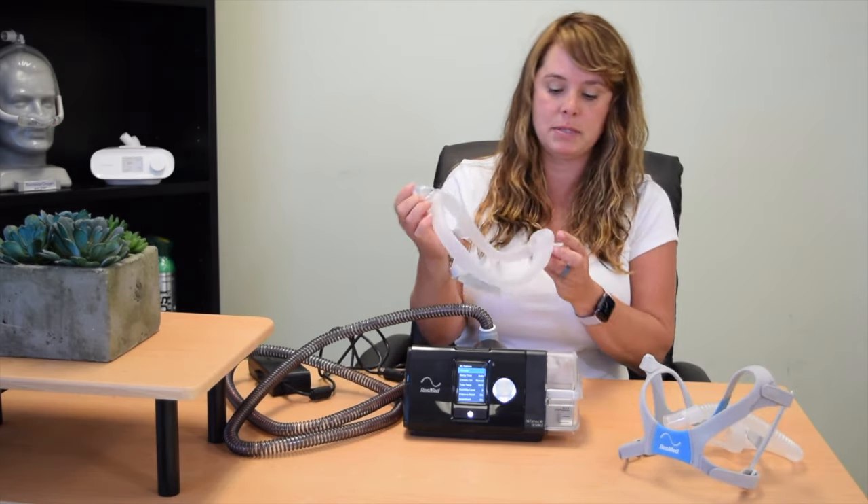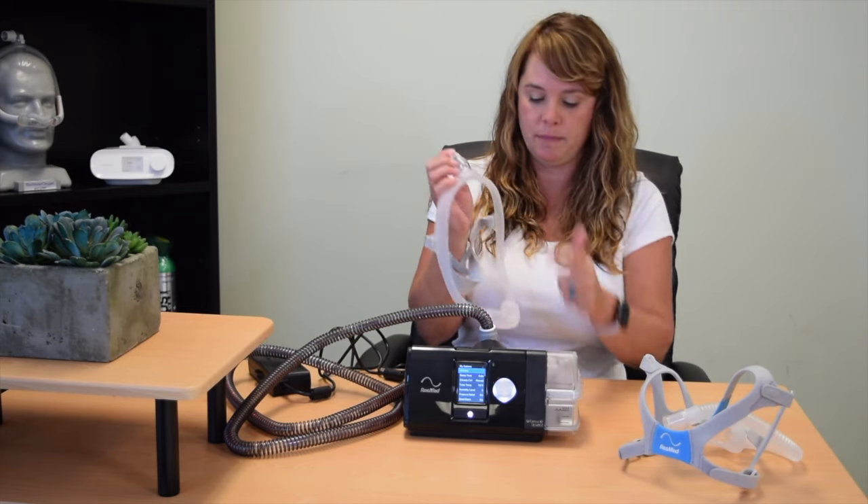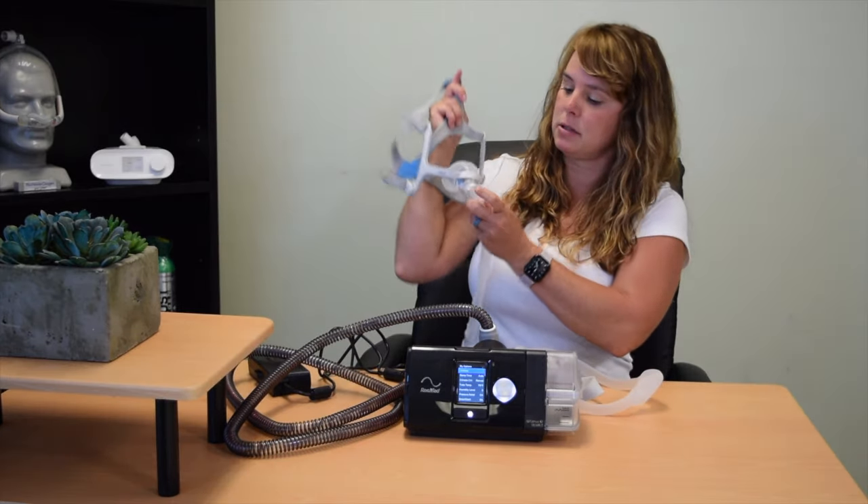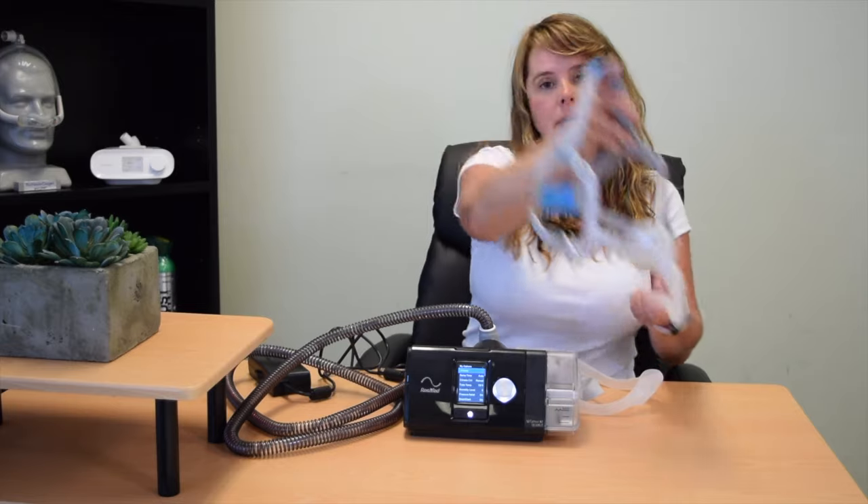Number five is the exhalation port. Every mask has an exhalation port — some have two. For example, the mask I'm demoing has two exhalation ports, one on each side. This other mask has just one, right in the front as a screen. The benefit of the exhalation port is it allows you to exhale your CO2 — you have to exhale your CO2. You're going to feel flow coming out of there; it's a continuous flow and it's supposed to be there. It's not an issue and it's not a leak in the mask. The exhalation port is correct — it should be there.